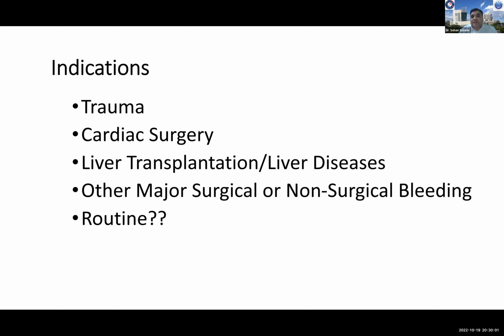In liver transplant surgery, it's very useful. You need a baseline value, and you need it during the anhepatic phase and the post-hepatic phase, you will need a TEG at every point of time. And you can also use it during major surgical or non-surgical bleeding, and you can also use it routinely if you want to replace your routine lab testing.